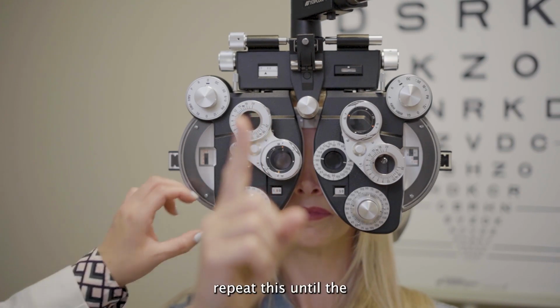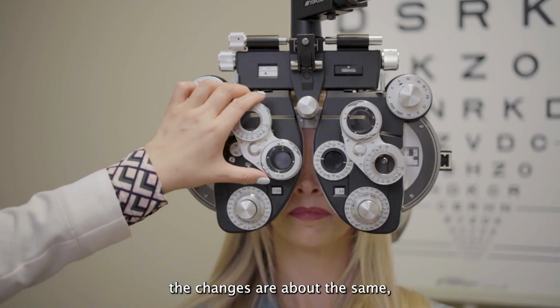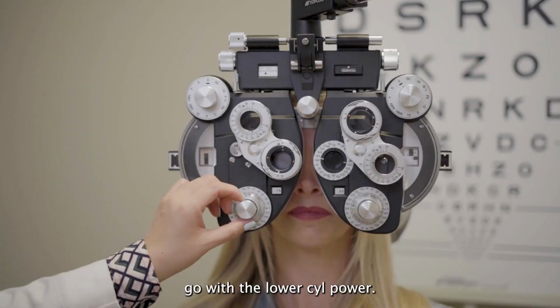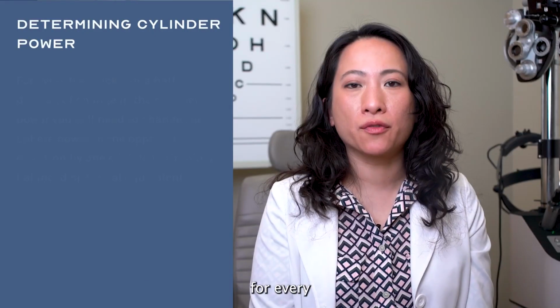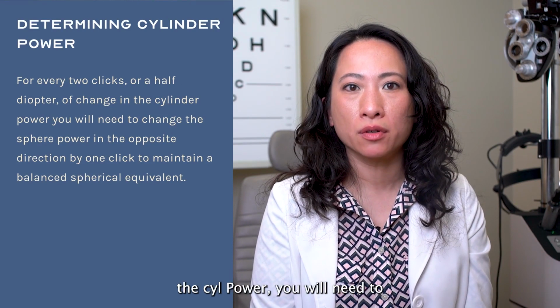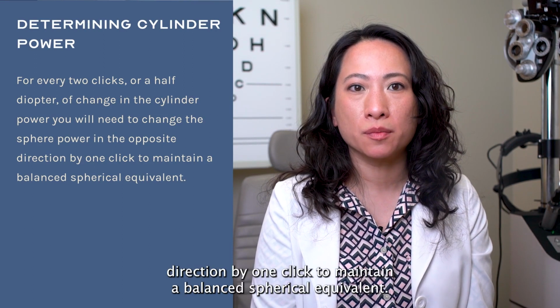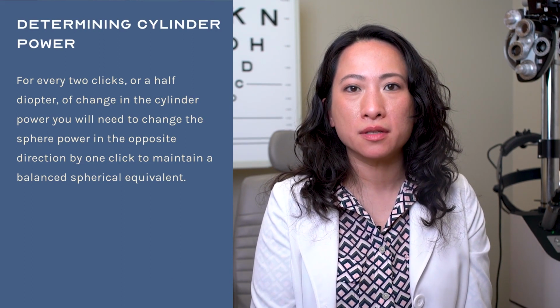Repeat this until the previous choice is sharpest, or the patient reports the changes are about the same. Go with a lower cyl power if the patient thinks they look the same. For every 2 clicks or a half diopter of change in the cyl power, you will need to change the sphere power in the opposite direction by 1 click to maintain a balanced spherical equivalent.